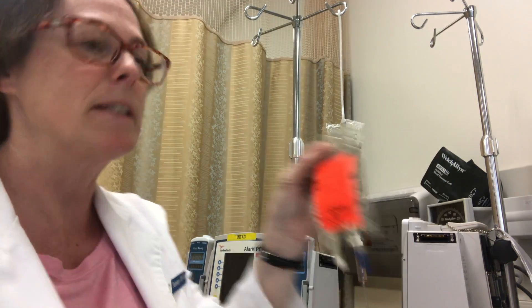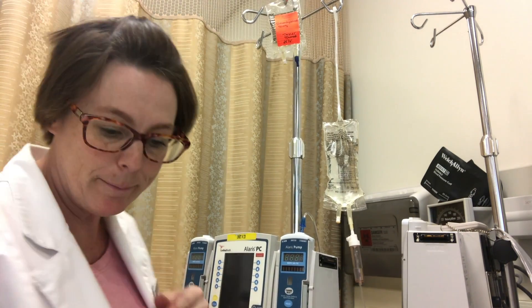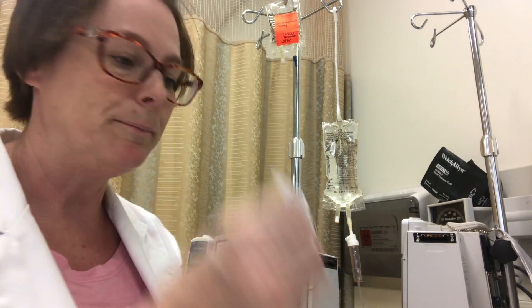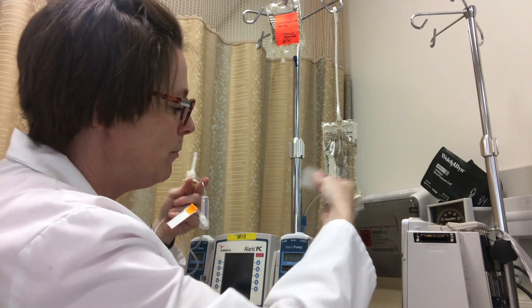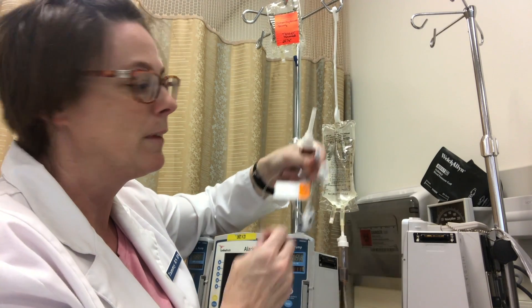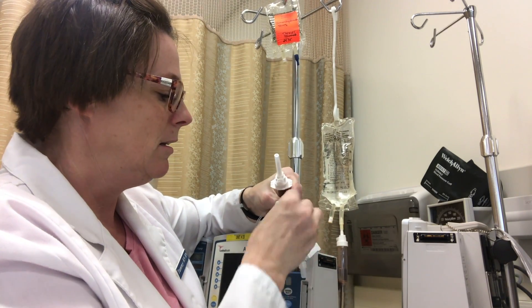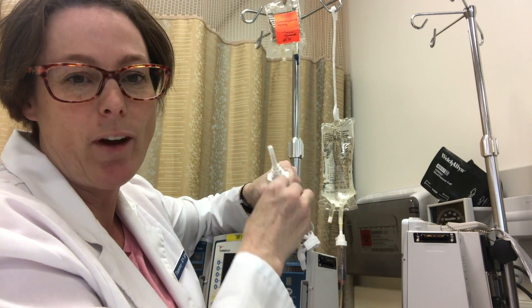I'm then going to hang up my secondary medication on the pump. Now to prime my secondary line I need my alcohol swab, and I'm going to clean the port of my primary line — that very first Y-connector that is above the pump. We're going to give that a nice scrub of 15 seconds.